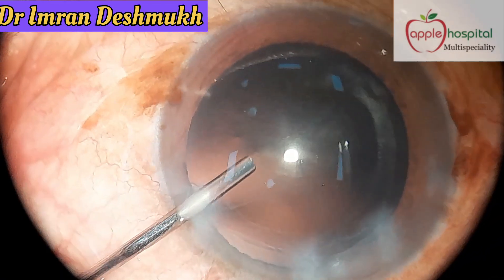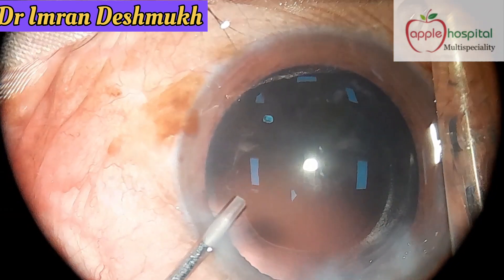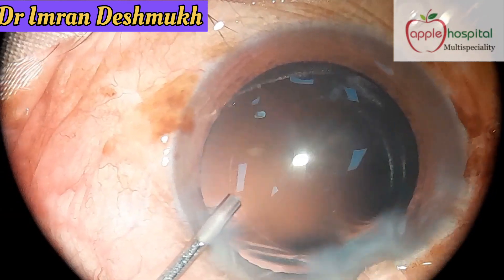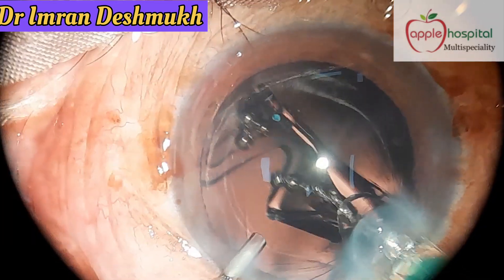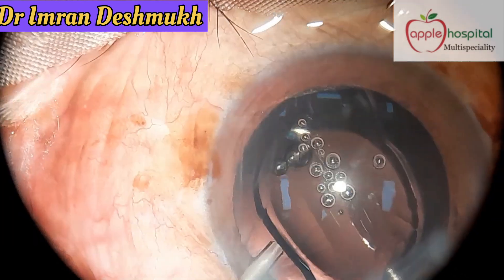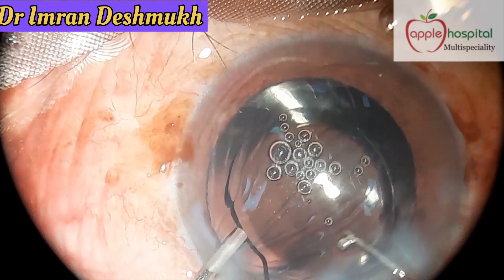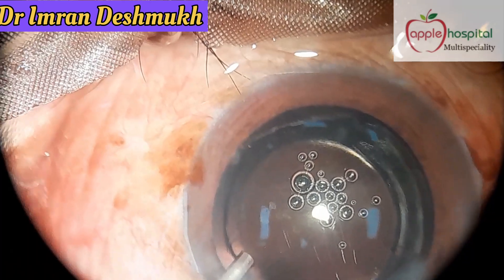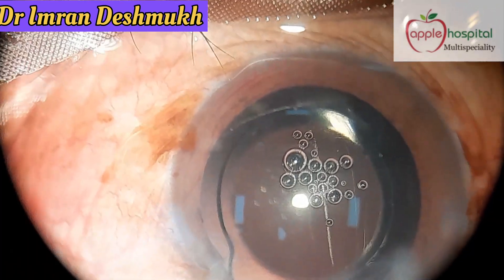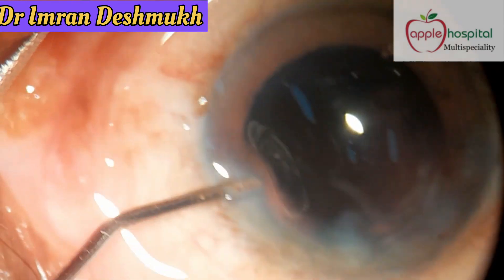Here's another case: a 24-gauge steel cannula through the side port, removing excess visco from the cartridge, injecting the IOL in the bag — see, that's smooth — then taking your T pusher or Y pusher and slowly pushing the IOL in the bag. That's done.